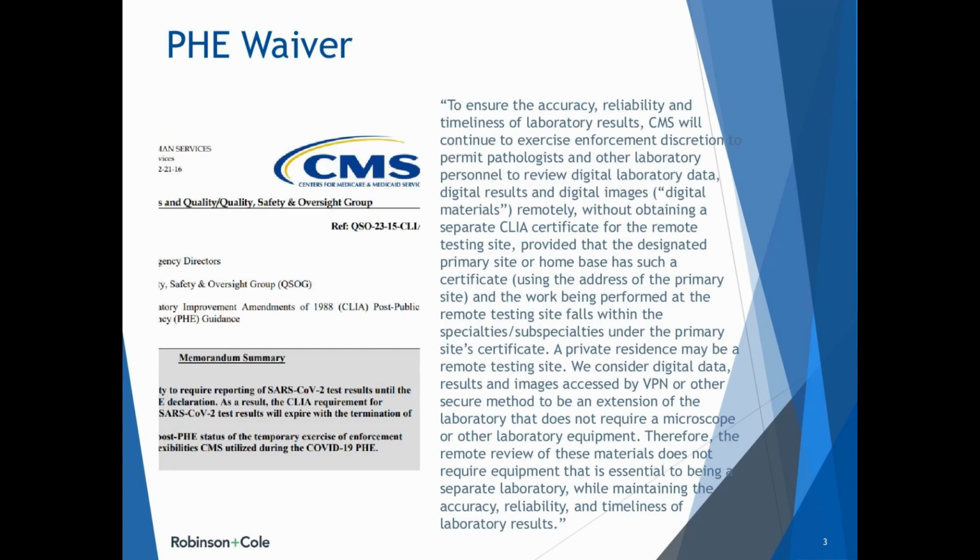digital pathology has been around for a while, but we saw a big rise of it right during COVID with the rise of remote work and things of that nature. And so there were some enforcement discretions during the public health emergency of COVID that allowed for a variety of scenarios that were typically not permitted to exist. Historically under CLIA, laboratories had to file a separate application for each laboratory location unless it met a specific exception. And, for cytology and cytology slide preparations, they had to be evaluated on the premises of the laboratory.